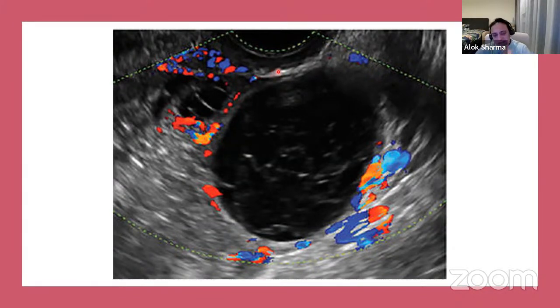This would be the pleura, it would appear like this. It's linear, it's hyperechoic. Very similar to the appearance you would see, for example, if you wanted to look at the pericardial margin when you have a pericardial effusion. But if you look at the deeper structure, the cyst, there's actually no change in the density of the fluid within the cyst except some septa margins.